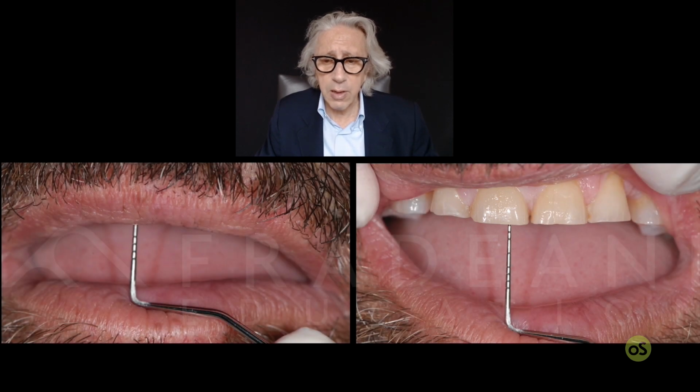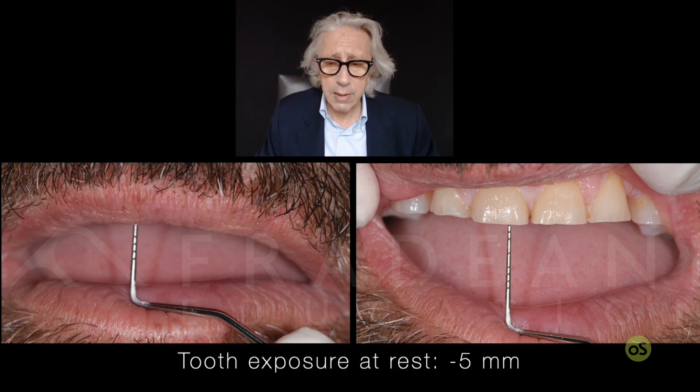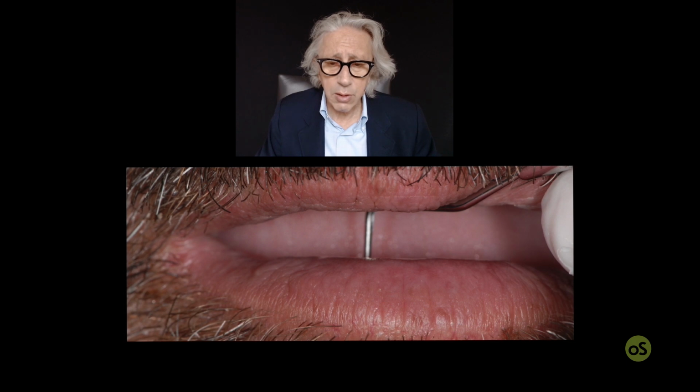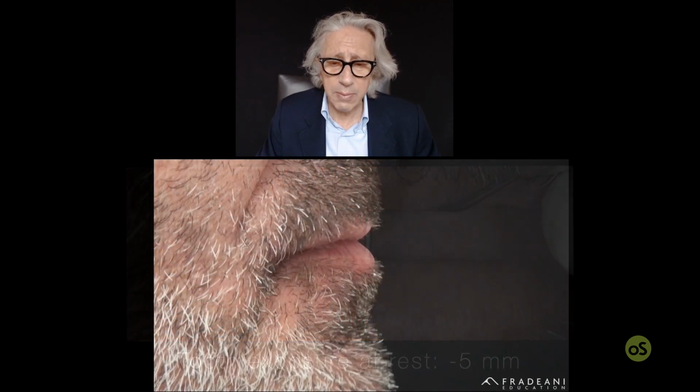So it means that you have no visibility of teeth, of course, at rest, but even during normal speech, normal life. And the lower arch is in a similar situation, still not visible at all, and the incisal edge is very, very far away from the lower lip line. So we should rebuild the teeth in order to make them visible during normal life. So the tooth exposure at rest on the upper and lower is -5 millimeters.